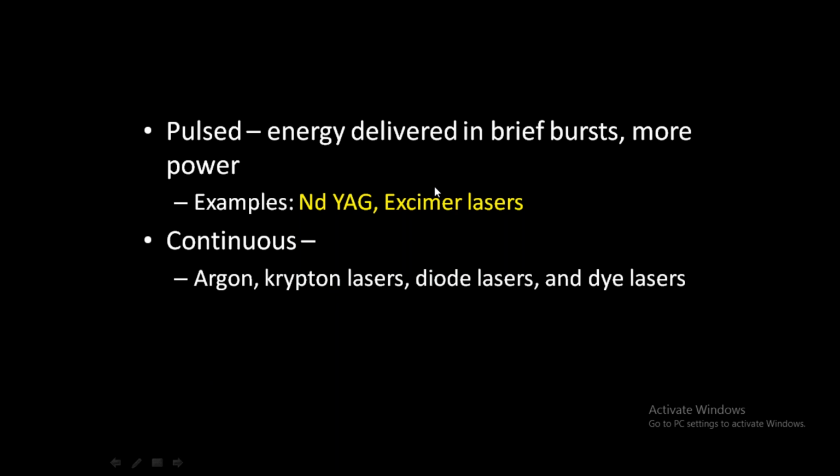Laser delivery is commonly used in two forms. One is called pulsed laser and one is called continuous form. Pulsed laser means you give it in aliquots. Let me give you an example. For example, you want to take curry from a bowl. You can either pour the whole bowl into your plate, or you can take small spoons. The effect is the same. Ultimately, the whole bowl is emptied into the plate.